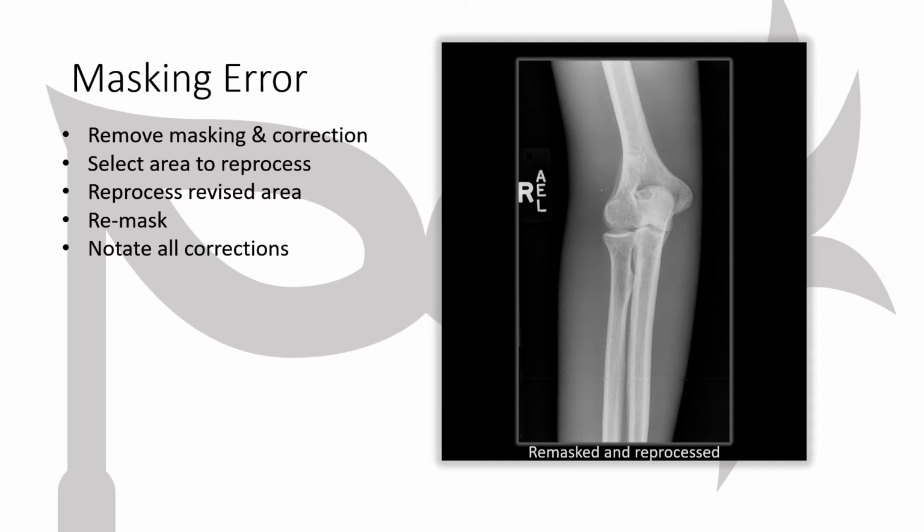This is the most important step. Annotate the change. If your department does not allow annotations on the image, at least record the change as part of the patient's report to the radiologist.